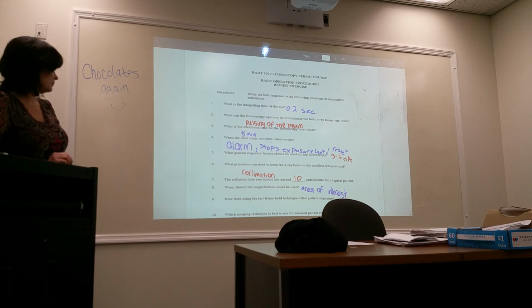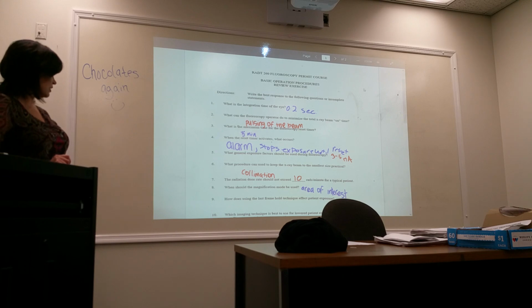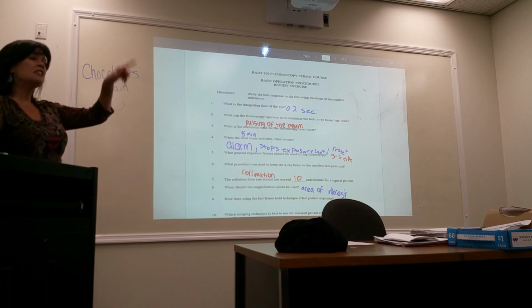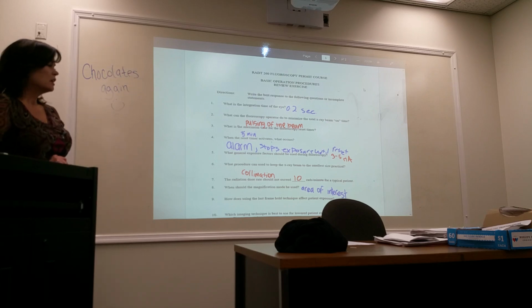Number 9. We didn't discuss this one, but you know that. They can compare the current image to the previous one, right? Yes, they do a kind of road mapping thing, but all your previous images you can see also.